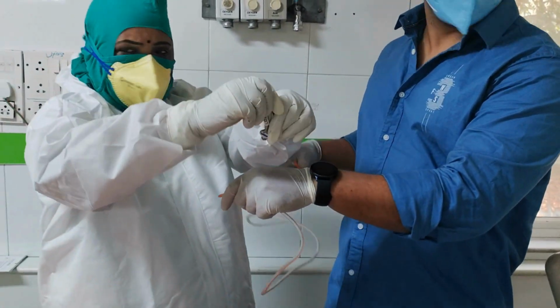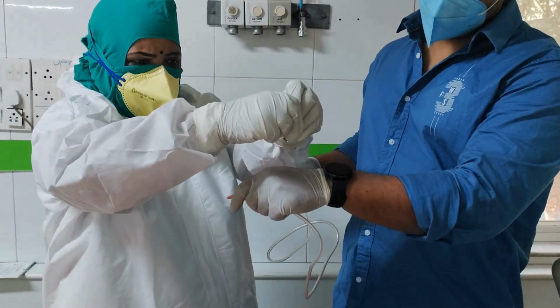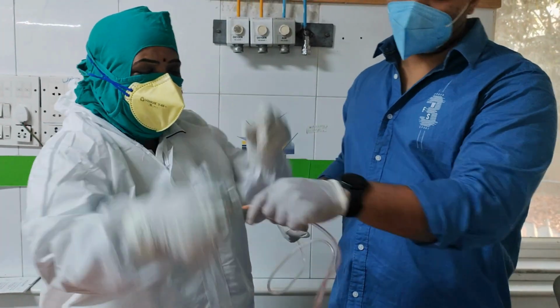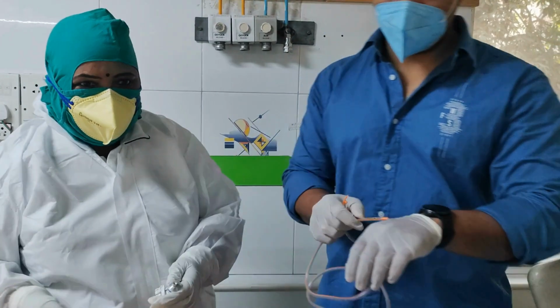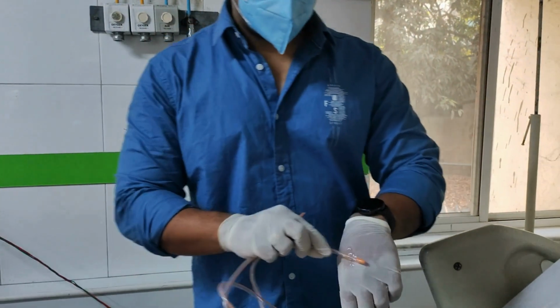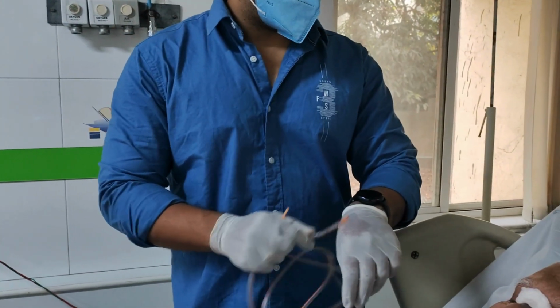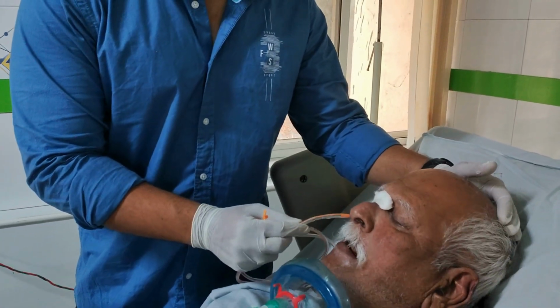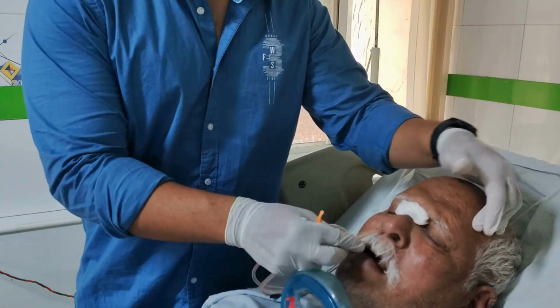Now, the next step is lubricating the Ryles tube. You want to do this generously. The more lubricated the tube, the smoother the insertion, and the less discomfort the patient will feel. Remember, the patient is already agitated, so anything we can do to minimize additional stress is crucial.